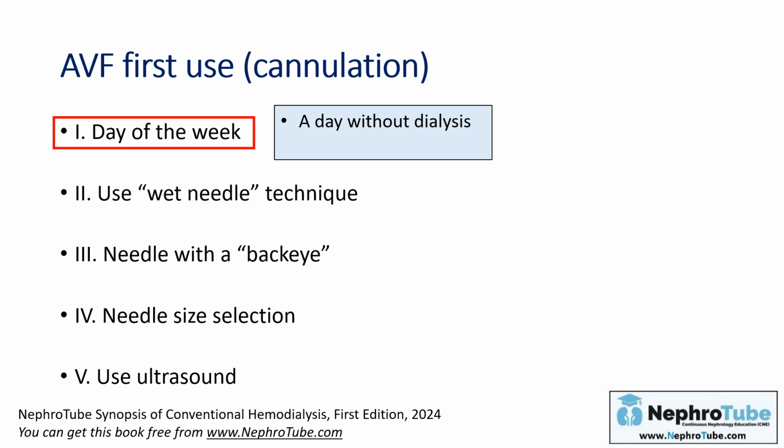If trial of cannulation on a non-dialysis day is not possible, then the initial cannulation should be done at a midweek treatment. For example, if the patient is dialyzing on Saturday, Monday, and Wednesday, the cannulation should be avoided on Saturday. It's better to be on Monday.